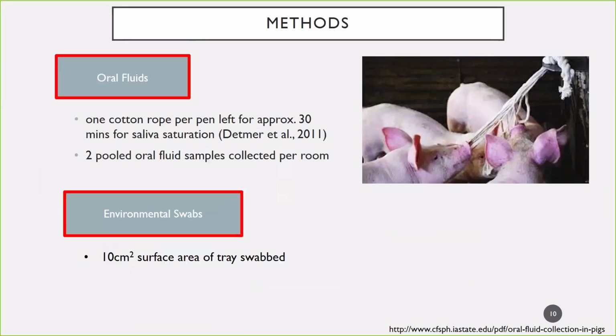So to collect the oral fluids, we attached a cotton rope into each of the pig pens. In each pig pen, we had around 30 pigs, and there were 8 pens per room. We collected 2 pooled oral fluid samples per room. The oral fluids are what we used as a positive control, so they basically told us if the room was positive or negative for influenza A virus.